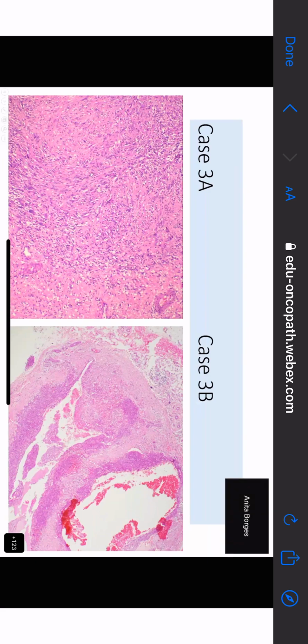And once again, a fascicle is a bundle. Irregularly arranged fascicles. Yes. But what is a fascicle? Can you define a fascicle, please, Vimy? A fascicle is a bundle made up of elongated cells in which all the cells are running parallel to each other and parallel to the direction in which the fascicle is running.